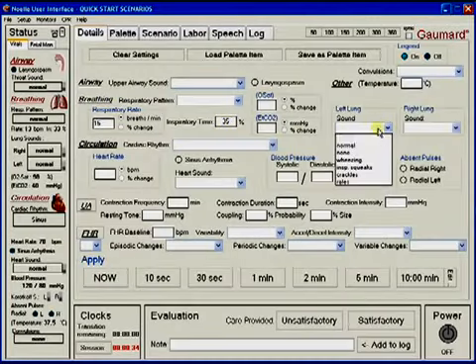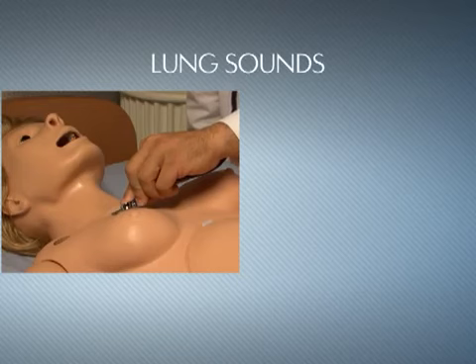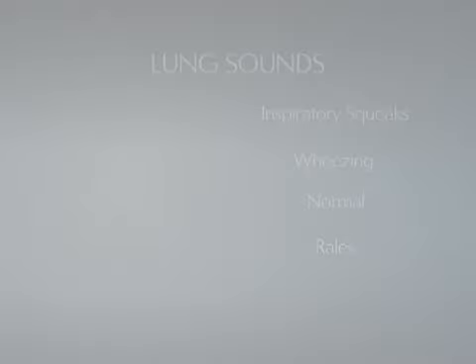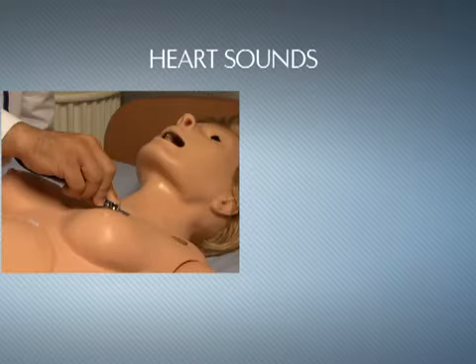Users can easily control rate and depth of respiration and choose independent left and right lung sounds, which are synchronized with selectable breathing patterns. Multiple sounds are available. Noelle is equipped with several realistic heart sounds, which are tied to a user-defined heart rate and selectable rhythms.